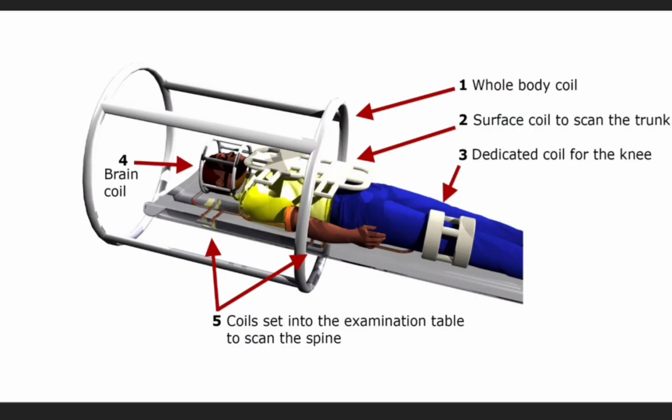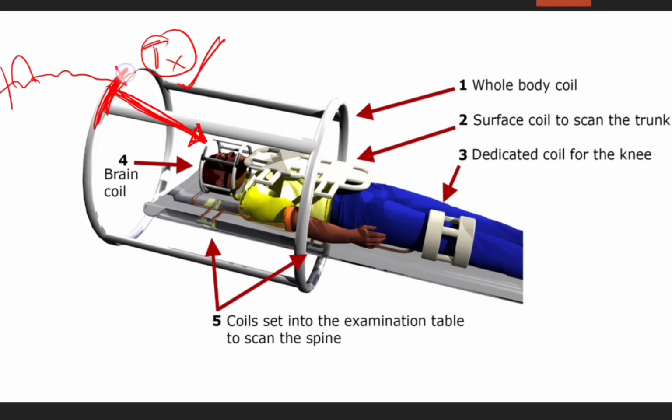Okay, so this is another good photograph showing the body coil. This is the transmit coil, this one is the RF coil. From this coil we are transmitting the RF to the patient body. So we are giving RF signals to this coil, and this coil is behaving like an RF antenna, and it will transmit the signal to the body.